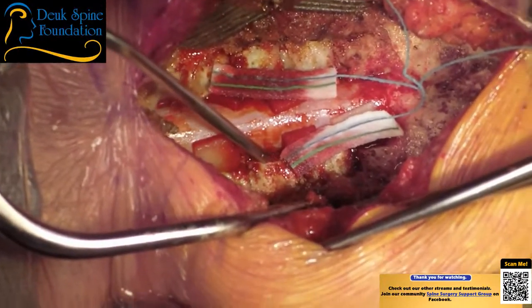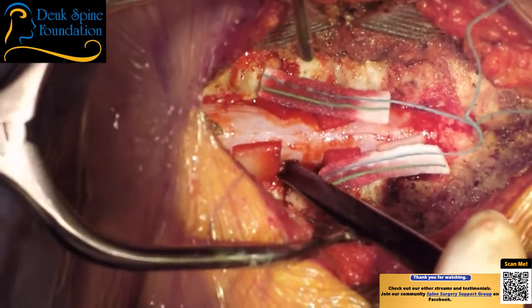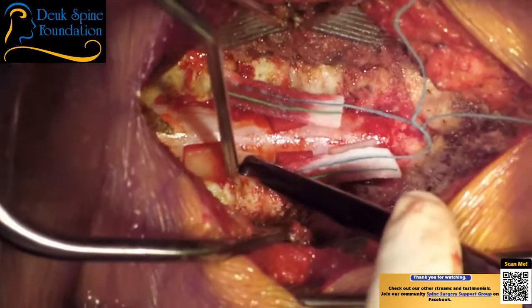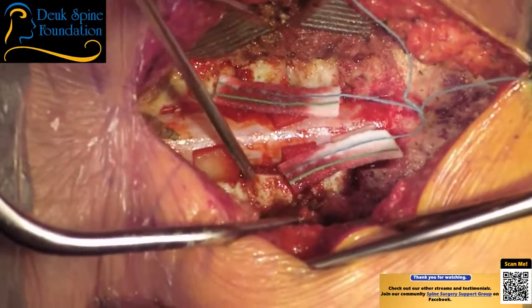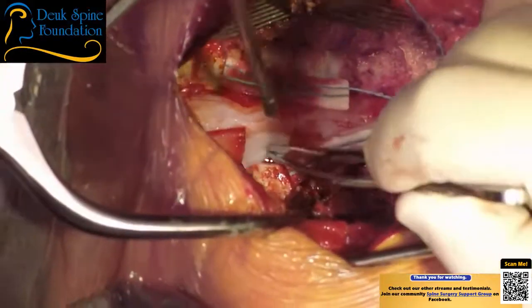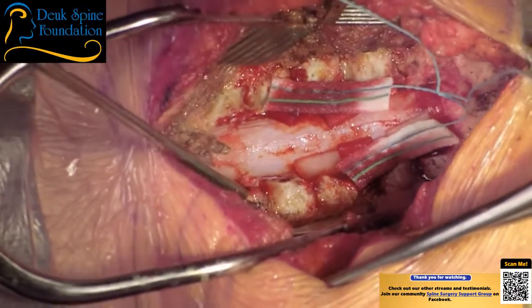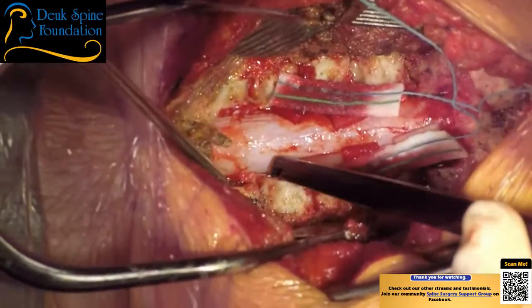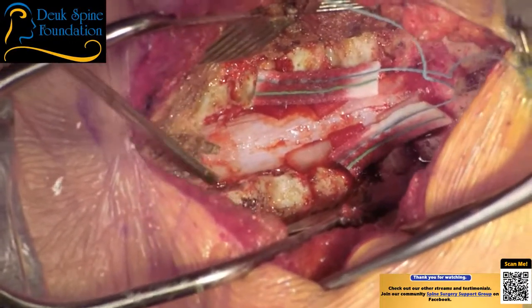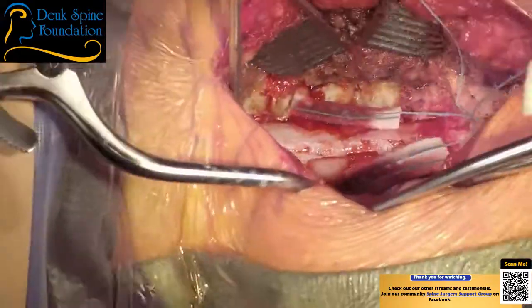Let's see that foramen right there. Let's see some rotation of the spine as well. Wipe. Let's see, did we get it all? Gelfoam. So this lady had ligamentous buckling and stenosis all the way up from C3 down to C7, sorry. I don't see anything at C2-3, so we're good.